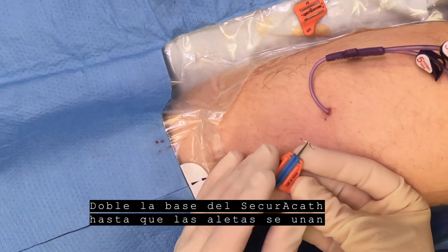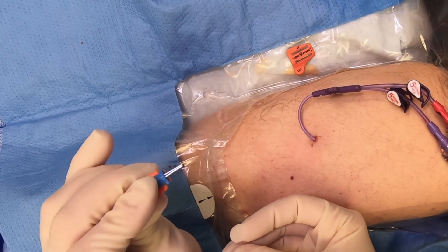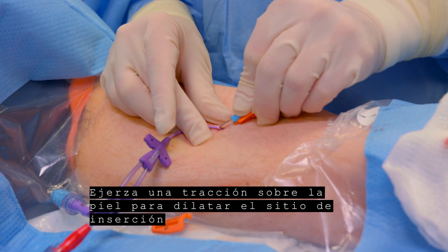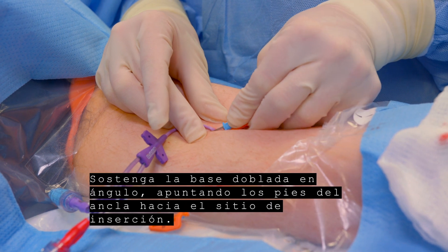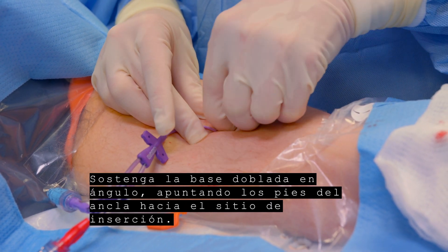Fold the SecuraCath base until the feet come together. Apply traction to the skin to help dilate the insertion site. Hold the folded base at an angle, aiming the tips of the feet at the insertion site.